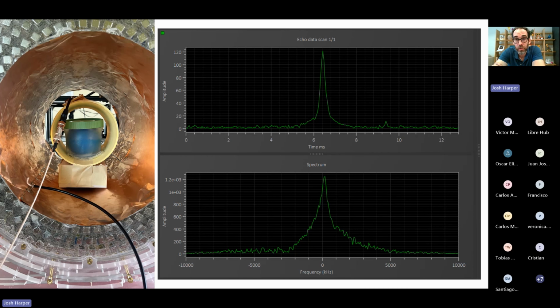So the first place that we go when it comes to imaging is a spin echo. And here I've got my knee coil, my 15 centimeter coil. I've got a water phantom inside of this Tupperware because I'm nervous that my water could leak out. And I want to make sure it stays contained. And I was just amazed at how quickly I was able to get a spin echo from this system using the Magritech spectrometer.